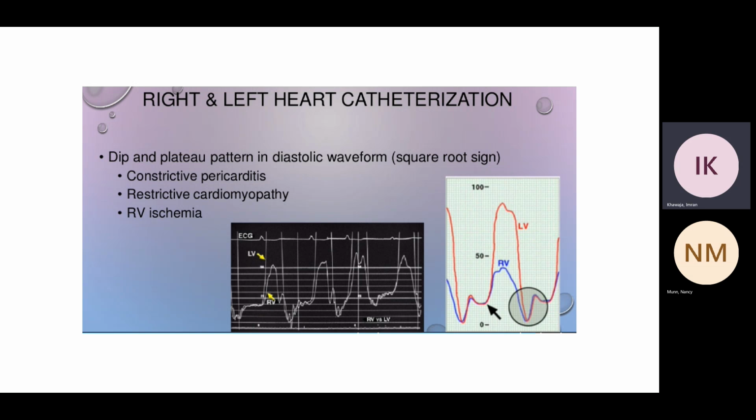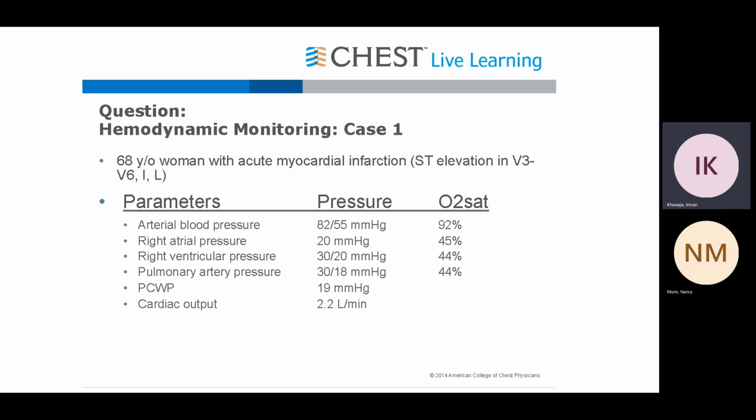If there is a lot of constriction of the ventricle itself, whether from outside or from inside, it will give you this dip with equalization of the diastolic pressures, together with the right and left. And the other thing you see is, you remember yesterday we talked about the Y descent. So the Y descent would be exaggerated with constrictive pericarditis. It will be absent with tamponade because you have pressure around the heart. It prevents the blood from going from the atrium to the ventricle.